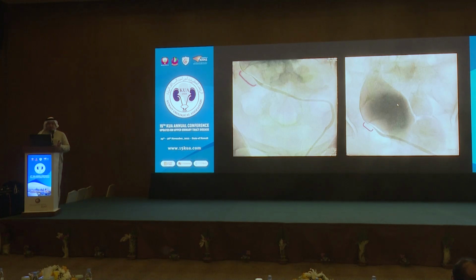During RGP, we found this. So another pathology is that she has a UPJ obstruction. So what do you think is the proper management for this patient? I referred her for laparoscopy, but they said it would be difficult because of the renal pelvis. And then next week, she's going to do robotic pyeloplasty, and he's going to go through one of the ports with flexible ureteroscopy to fragment that stone.